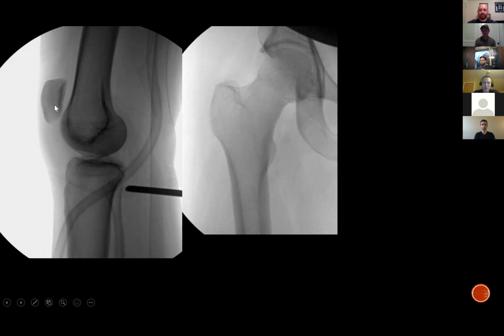After you obtain a perfect x-ray of the knee, you roll the fluoroscopy C-arm up 90 degrees. No one moves anything, and you slide straight proximal up to the hip. And you take an x-ray of the hip. There you focus all of your intensity, all of your eyeballs. You focus on the profile of the lesser trochanter. How much of that lesser trochanter is peeking out from behind the femur, okay?